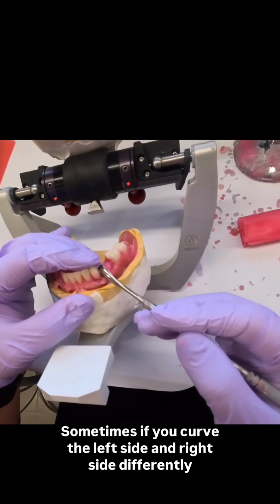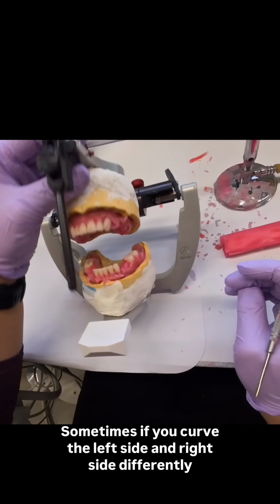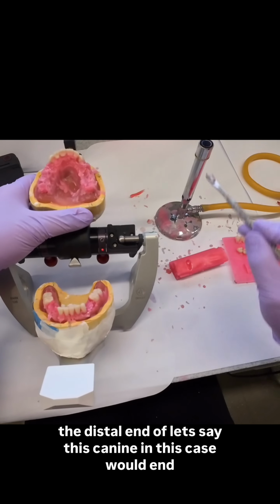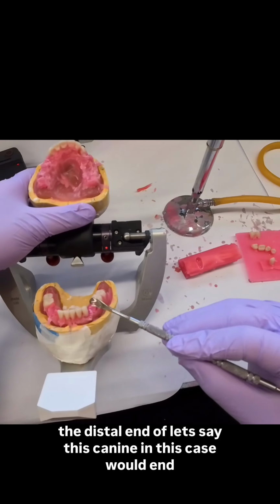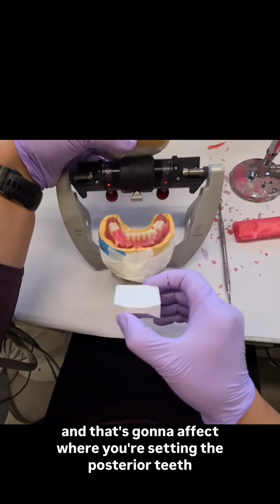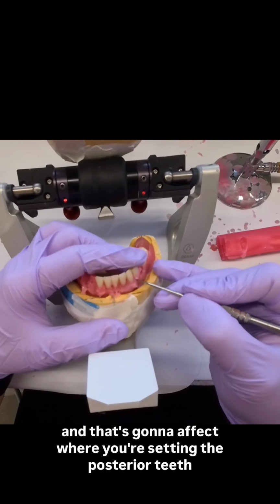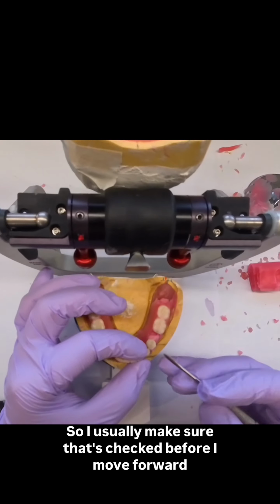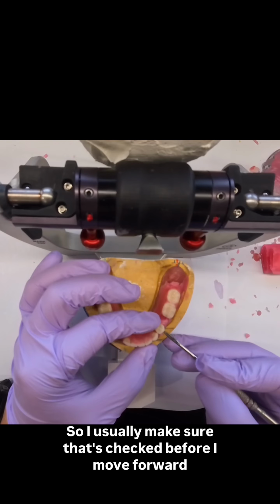Sometimes if you curve the left side and right side differently, then the distal end of the, let's say, canine in this case, would end differently, and that's going to affect where you're setting the posterior teeth. So I usually make sure that's checked before I move forward.